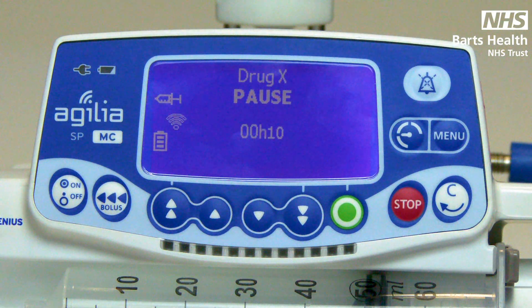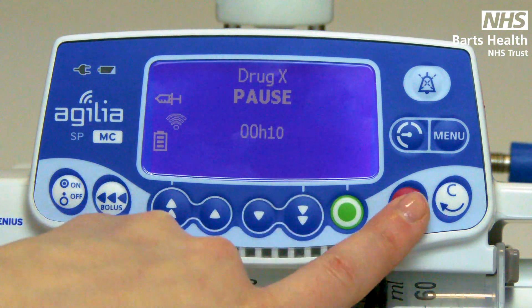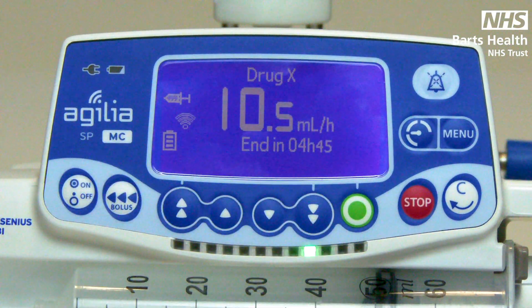At the end of those ten minutes there will be an alarm to check if you want to restart your infusion, or if you are ready beforehand and wish to override the pause, you just press stop and restart your infusion.